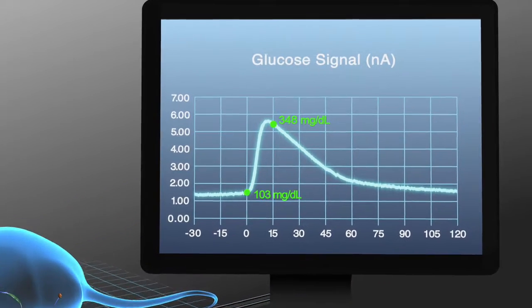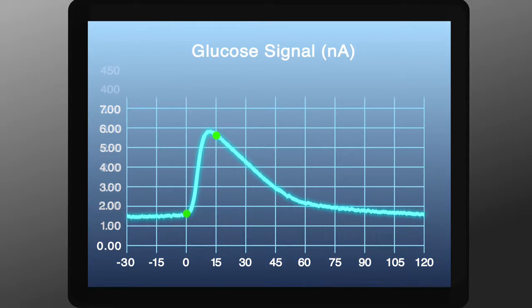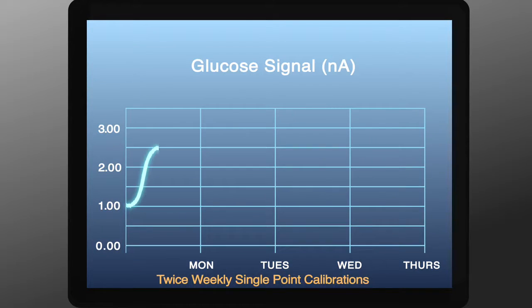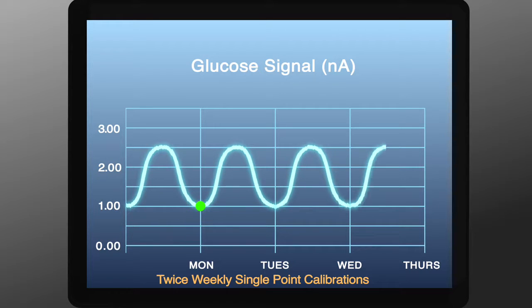Successful completion of the initial multi-point calibration establishes a linear relationship between the sensor output and blood glucose levels. Following the initial multi-point calibration, it is important to take twice-weekly single-point reference values at the same time of day when an animal's blood glucose is stable.